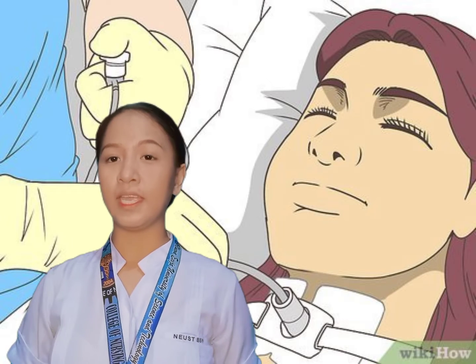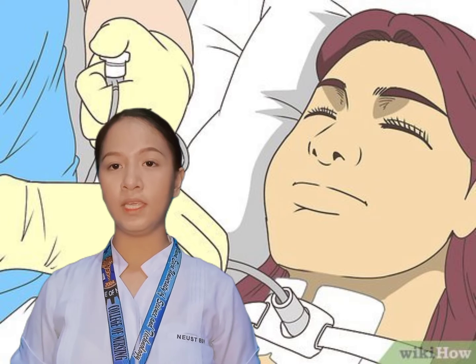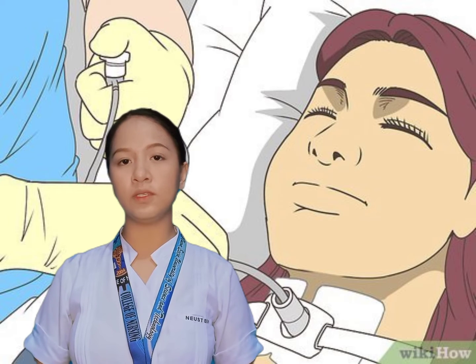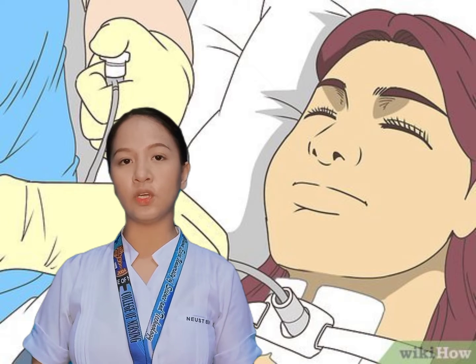Good day, everyone. I am Jeka Javier from BSN 3F, and I am here to perform providing care for tracheostomy. For the goal, the patient exhibits a tracheostomy tube and site free from drainage, secretions, and skin irritation or breakdown.